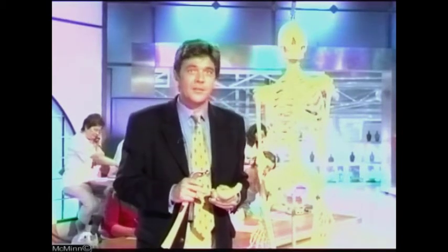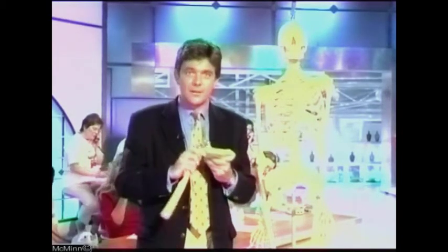The Birmingham Hip Resurfacing technique is available on the NHS, but a conventional hip operation costs £4,000. This procedure costs £7,750, and only 34 surgeons have so far been trained in the technique, so there's a waiting list. And the implant is only suitable for 1 in 5 patients needing hip replacement surgery because successful resurfacing requires good quality bone to support the implant.